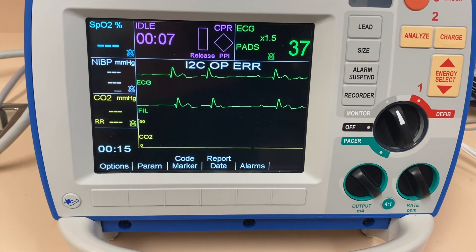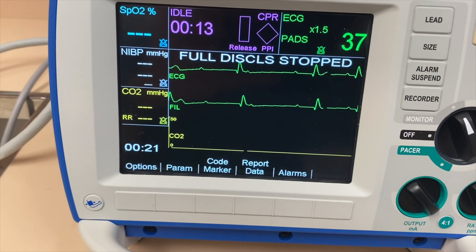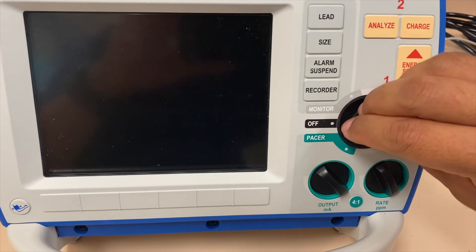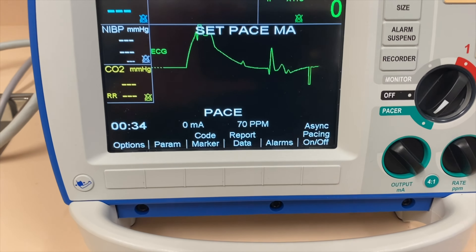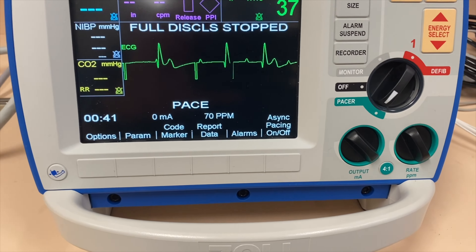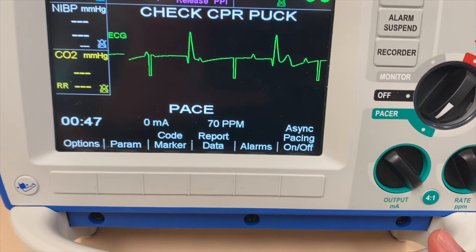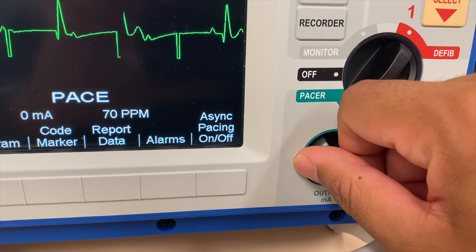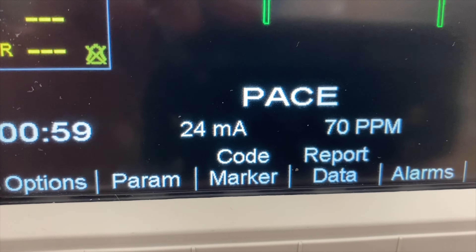The last feature I wanted to show you is pacing. This monitor is now showing a third-degree heart block. For you to be able to pace, all you have to do is turn your knob to the pacer section. You'll be able to see that the machine actually sets this up to 70. First, verify your physician order — what rate do you want to start pacing at? At the bottom of your screen, you would see the rate and the output. Let's pretend the rate was set to 70, then you increase your mA and you would see the mA being changed here until you see a capture.